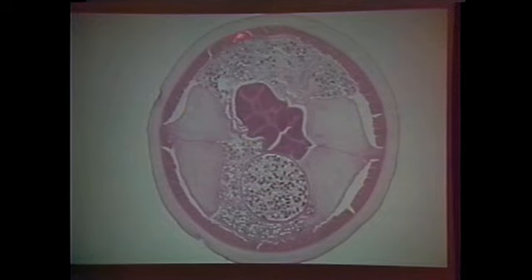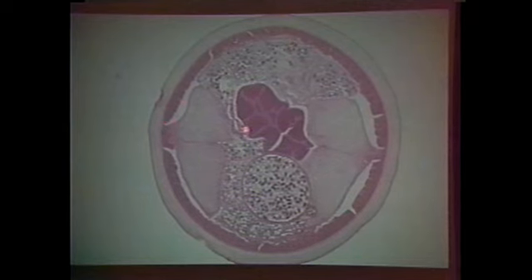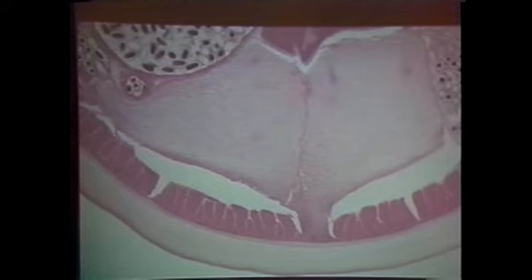It's kind of like a mesenchymal layer that lies between the cuticle and the muscular layer in your nematodes. It bulges laterally to form sometimes immense lateral cords like this. These are big lateral cords. The lateral cords would also be described as being divided into sublaterals. There are two of them. You see? Here they go. Separates the muscle. Those are lateral cords.